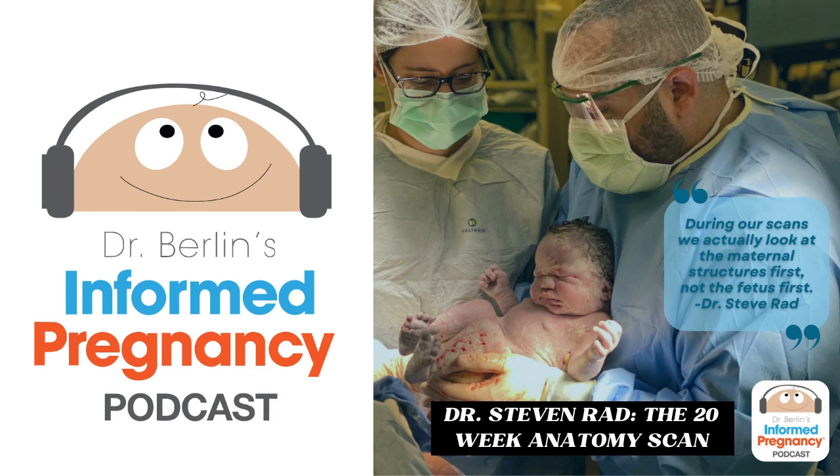So that's the typical setup. You can usually bring a partner or support person, family or friends, whatever their visitor policy is. And then at that point is when things can be variable. Your anatomy ultrasound can be as fast as 5 to 15 minutes. There are some sonographers or maternal fetal specialists who can do the scan in 5 to 15 minutes.